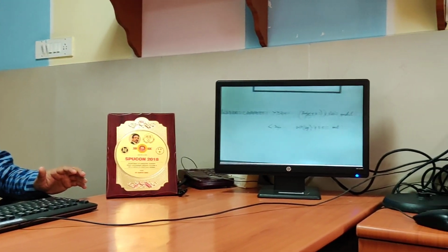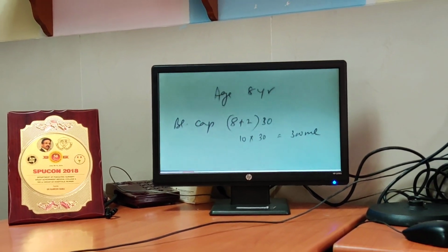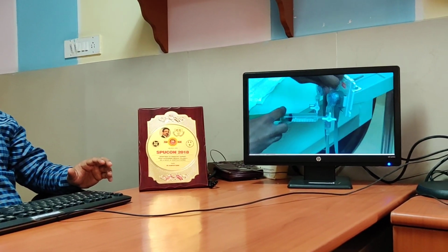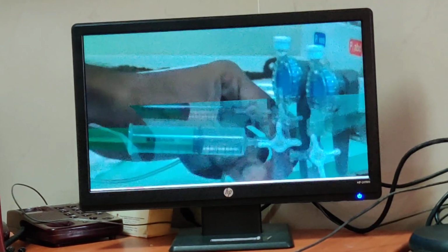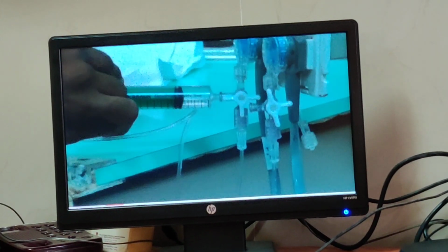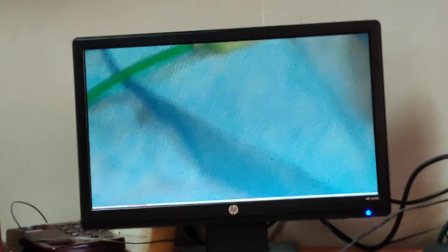So a calibration of the transducers involves adjusting the rectal pressure, and this is the transducer being adjusted. Once the air bubbles are gotten rid of from the transducers, we have to insert the rectal line and the vesical line and adjust the rectal bulb pressure. The rectal bulb pressure is often adjusted by deflating a little bit of the rectal balloon, and we make it in such a way that the P abdomen is around 15 to 20, so that if P vesicle is 20 again, you get a P det of 0.